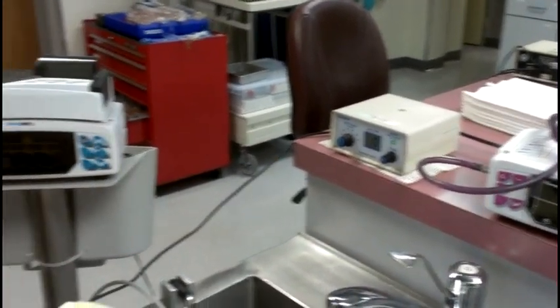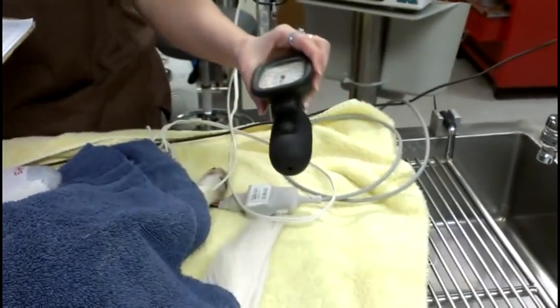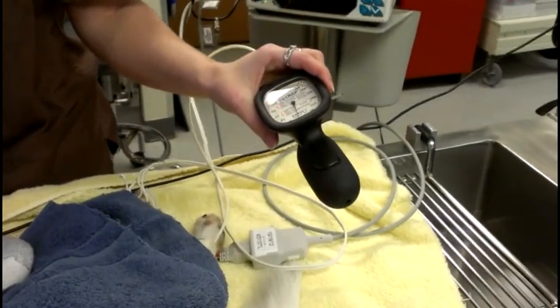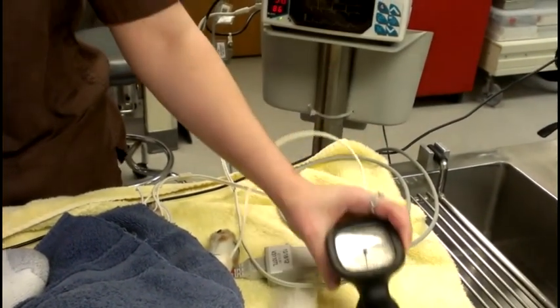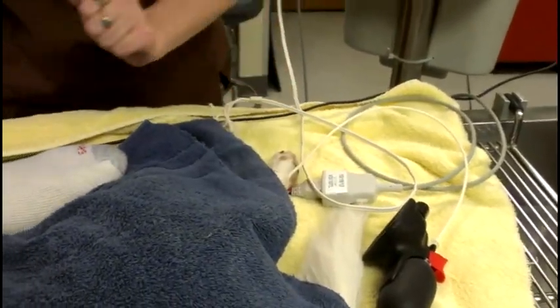If for some reason she does not want to breathe under anesthesia, I would then breathe for her with the oxygen. We're also monitoring her blood pressure. We get both a diastolic and a systolic rate, the same as they would do with us in the hospital. So that is attached to her leg.